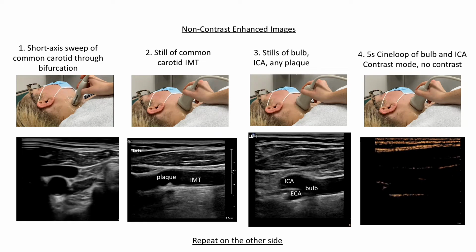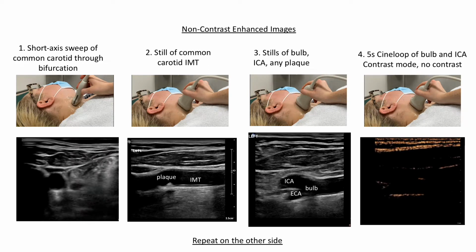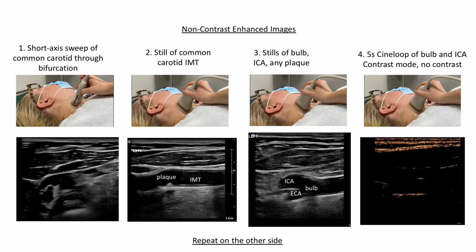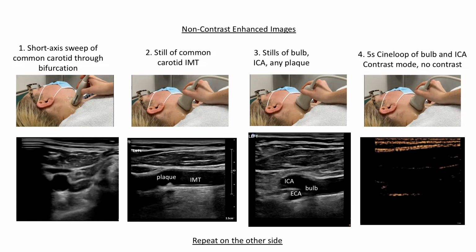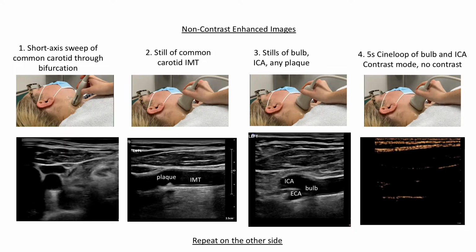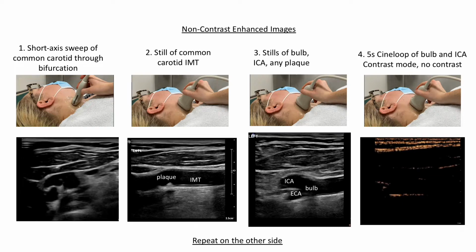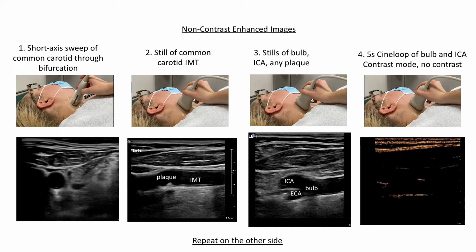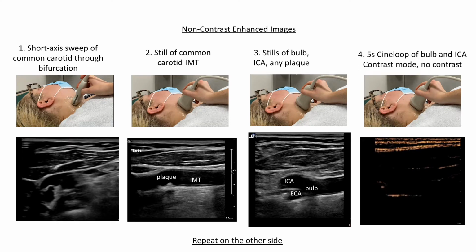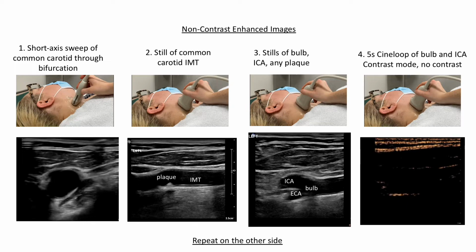This is typically easiest to do at the very beginning of the echo while patients are still lying horizontally on their backs prior to your baseline images of the heart for the stress test. But you can get these images at any time in the exam as long as there is no contrast in the blood vessels. In other words, the heart rate does not matter for any of the images needed for CIRCE and can be done whenever is convenient in the exam as long as some are retrieved before contrast.